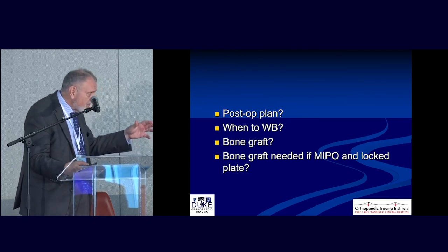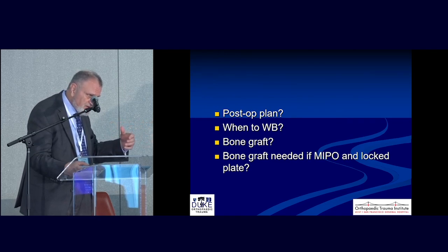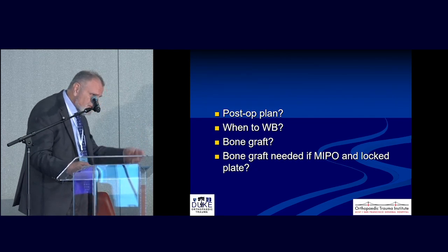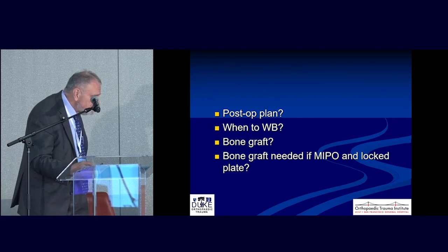But if I think it's within normal for a LISS, and you ask me what that is, and it's because I've done a few, then I don't think I would add a medial plate for the reasons we talked about earlier. I think it's a biologic insult, and it really causes some joints to be pretty stiff. Andy or Kyle, do you guys use medial plates in these? You go back to your X-ray.